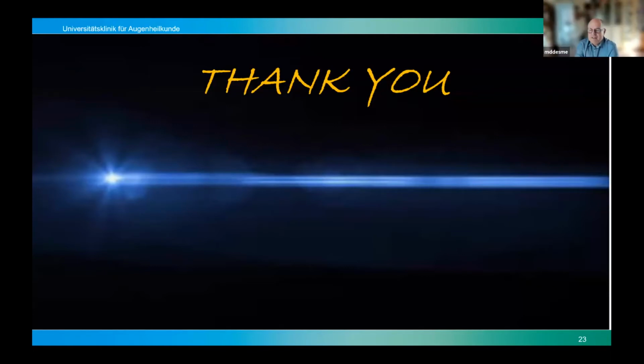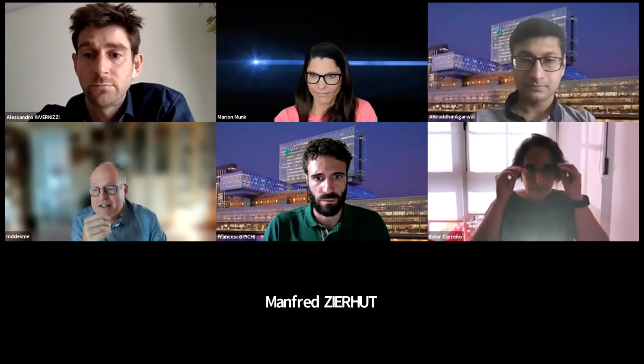Well, thank you, Marion. And in fact, you're bringing up one of the first questions that came up in the Q&A, and one that I have also. All of these technologies are fantastic, and I've used this flare meter in the past, and you've identified one of the major drawbacks, I think, which is in fact the cataract development. In a study, it might not be a major problem. But when we test new machines, we always test them under ideal conditions. And so one of the questions that comes up for you, Alessandro, with what you've done, and for you, Marion, with regards to this device, is what are the limitations?